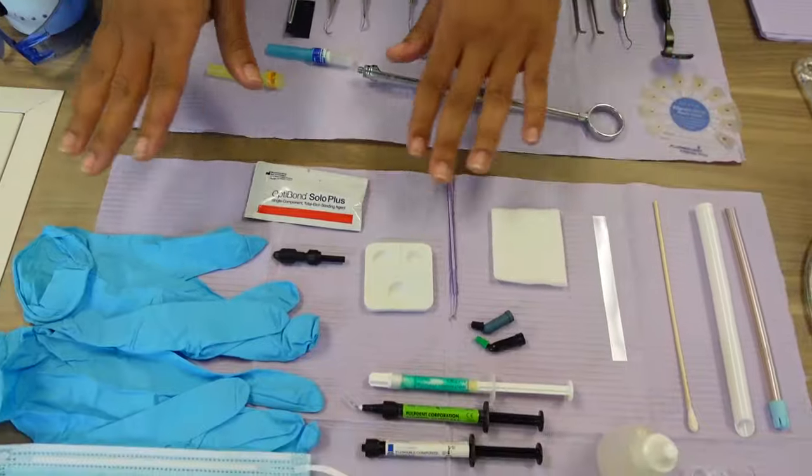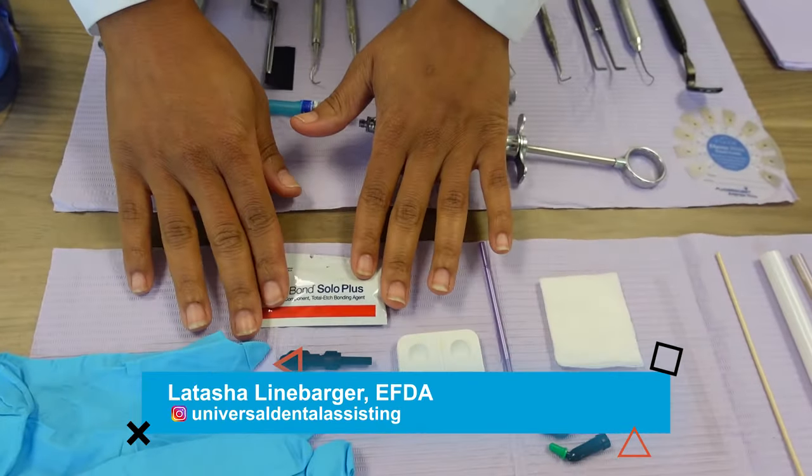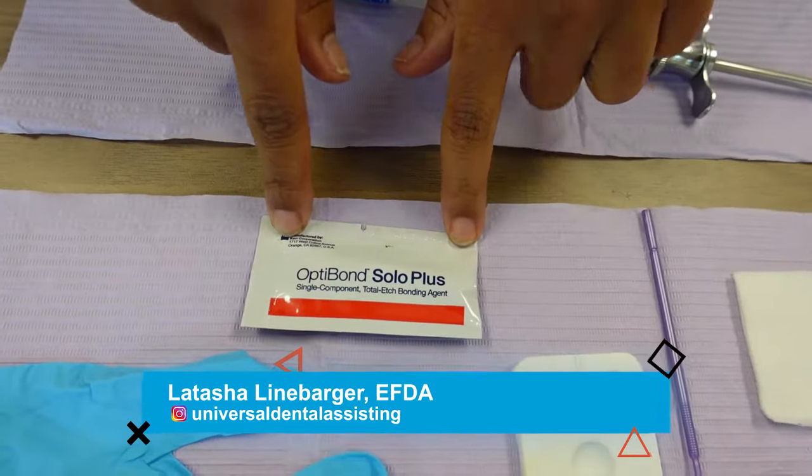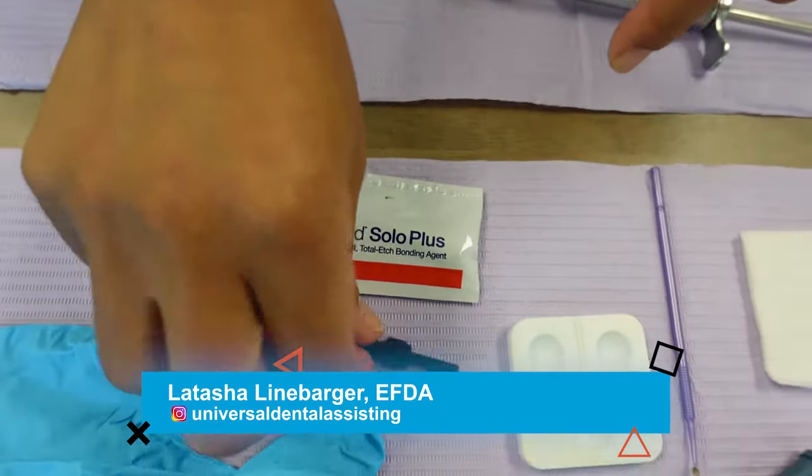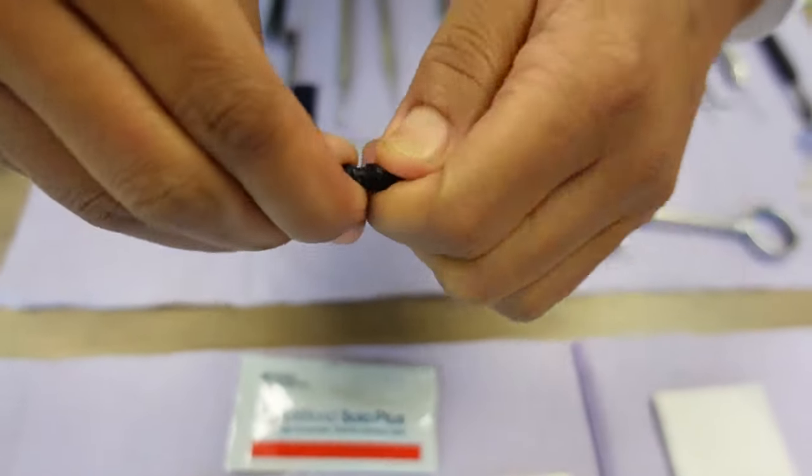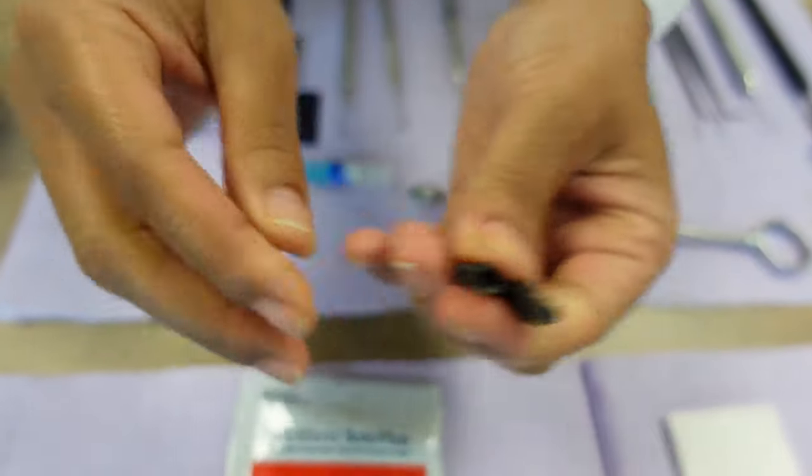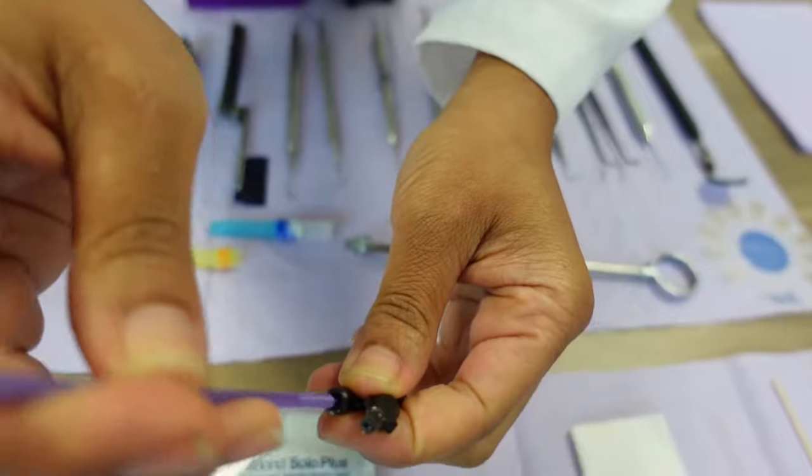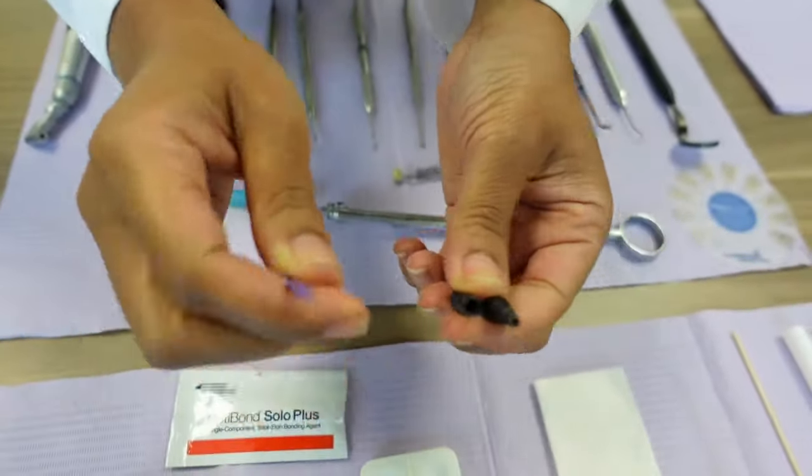So with the composite setup, we also have the bond, and the bond is used so the material can adhere to the tooth. This is OptiBond Solo Plus. We use that because it's simple—we can just snap it open. This is an older one that's been used, but it's not going in a patient's mouth. So we'll dip it in some bond and hand it to the doctor, and it goes on the tooth.